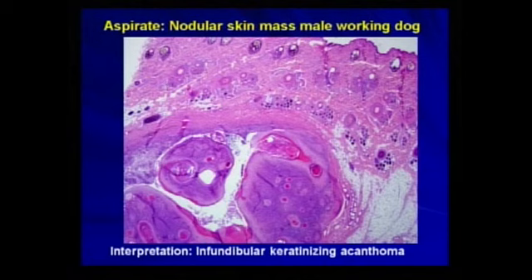And what happens more often than not is you don't get much because you've squeezed all the keratin sideways into the tissue. Okay, and you're going to set up a really nice suppurative or pyogranulomatous response. So the inflammation, the neutrophils go very nicely with that keratin that we saw, and tells me that somehow some of this has been released into the surrounding tissue. As long as there's no release into the surrounding tissue, okay, there won't be any neutrophils.